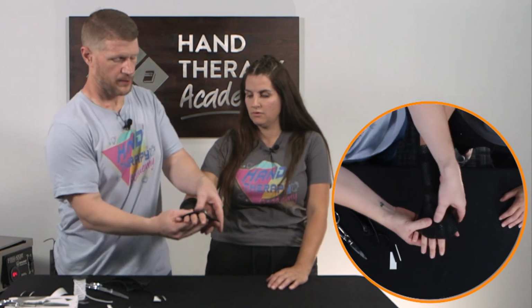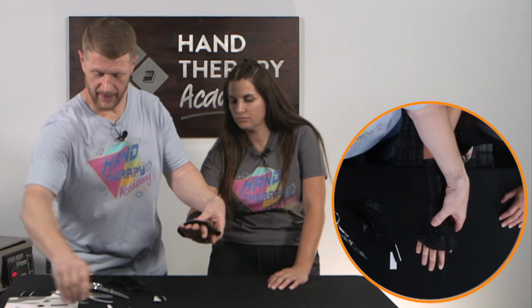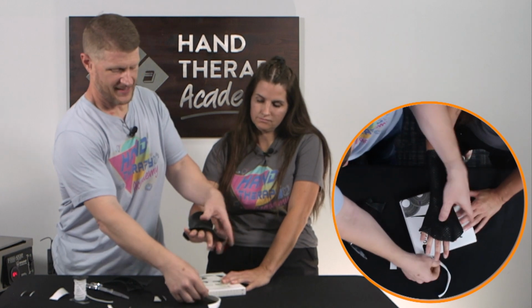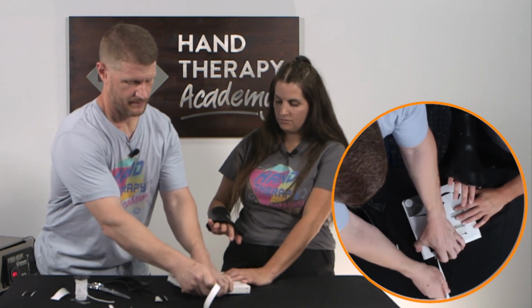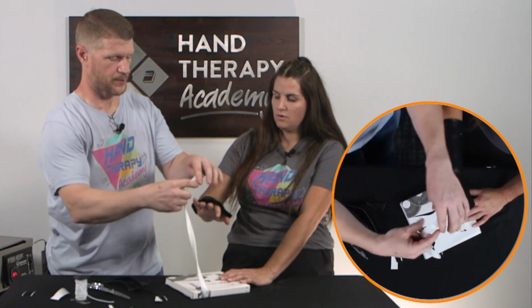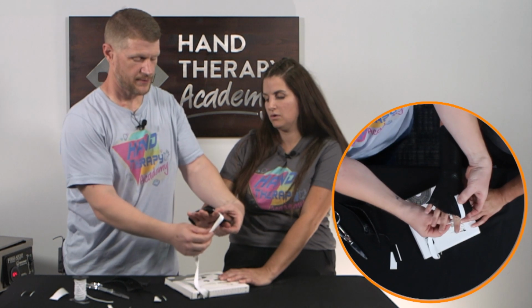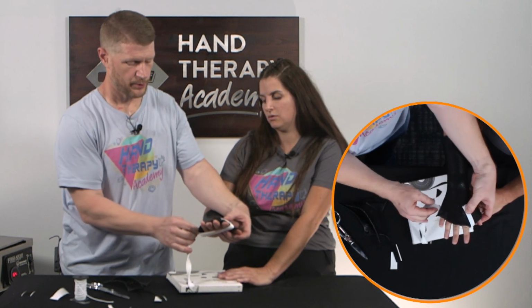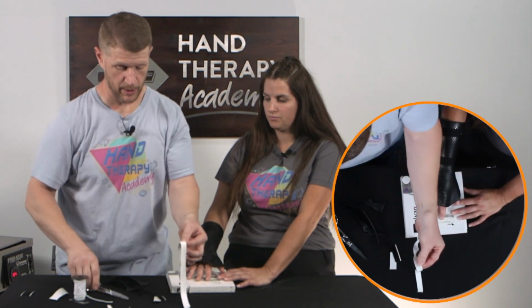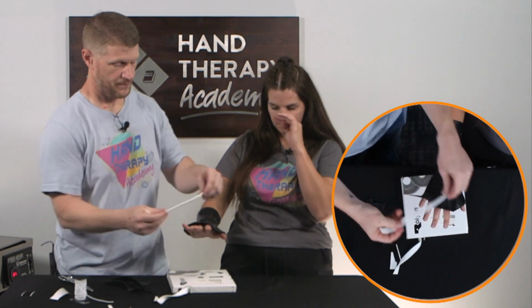Okay, and we're going to come here. And I'm going to work on identifying first how long I want this strap to be. So, thank you. It's a little stuck in there. Okay, so if I run it from the index finger around and I come across the back side, I need it about that long, okay? And I'm always going to cut longer because I can make it shorter later, can't make it longer later, okay?